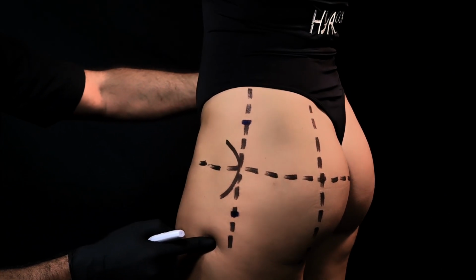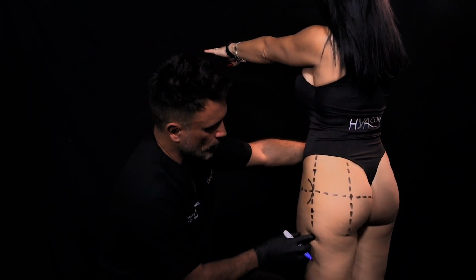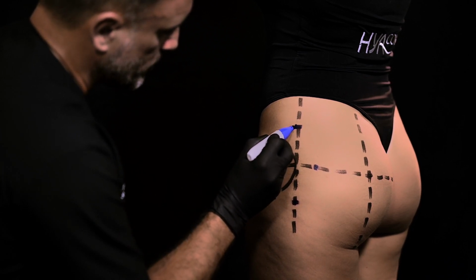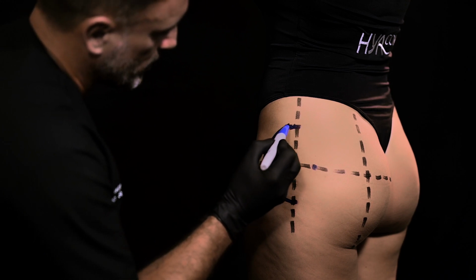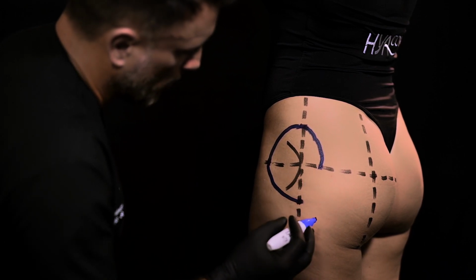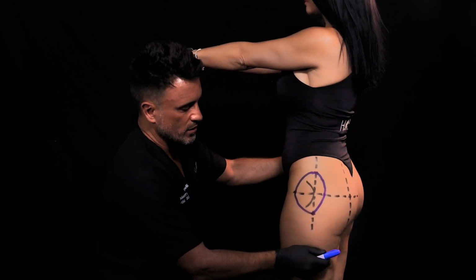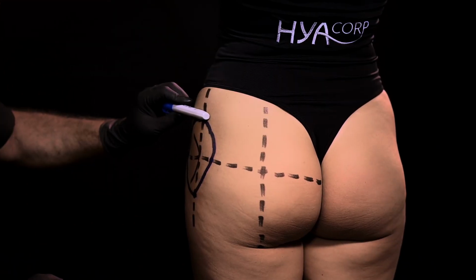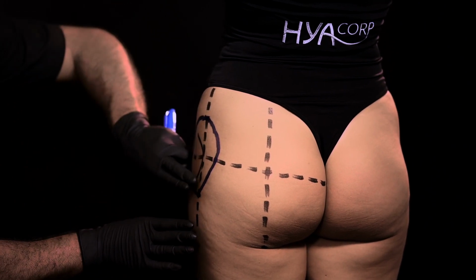We want to have an effect from the front, so we will go quite anterior. I call that anterior hip expansion. And finally, from the posterior part, we will go somewhere a little bit in the lateral butt. So now I'm ready to mark this zone. As you can see, it's mainly on the hips, but a little bit also in the lateral butts. This is the zone of injection of HYAcorp MLF2 in the hips, and you can appreciate again that we will go from this point to this point. It's very important to appreciate these two convexities and in between this depression.